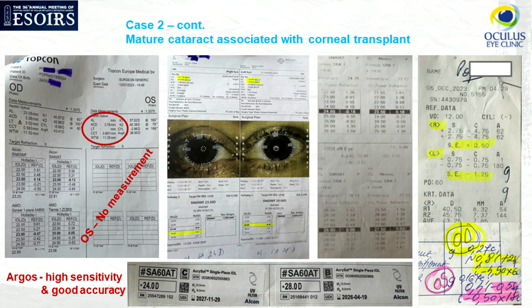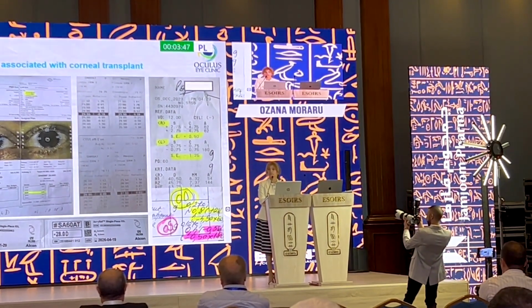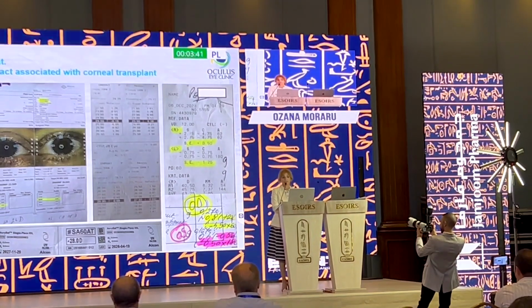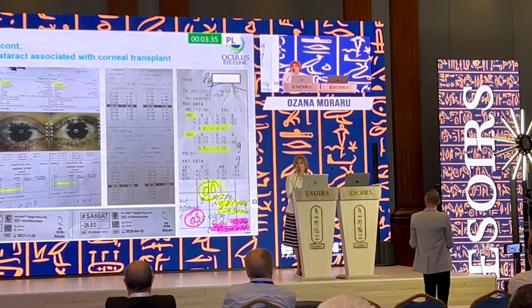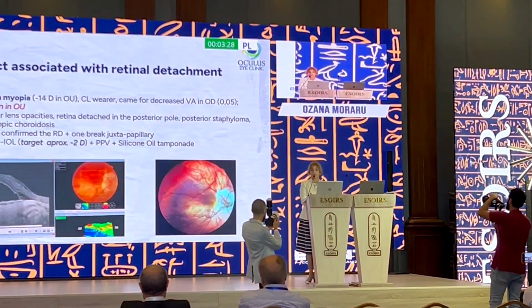And we wanted to check once again with the OPSCAN machine, and we obtained a similar result. And indeed, we followed the results given by the Argos, and we have almost emmetropic in the right eye and minus 1.25 in the left eye. So we are quite happy with results. In the subjective refraction, you can see the results are very, very good, very close to our target. It proved again a high sensitivity and good accuracy.